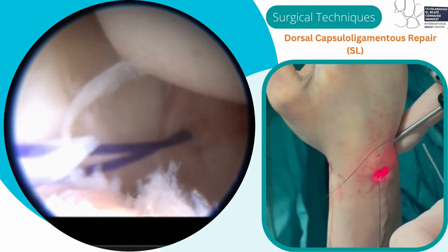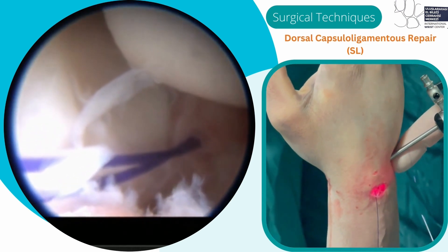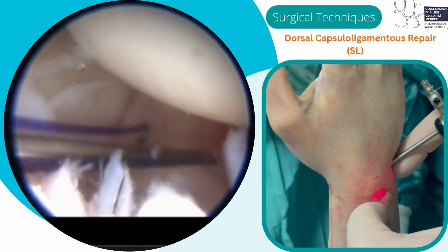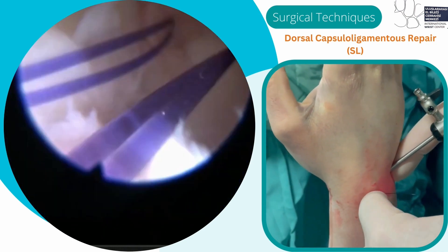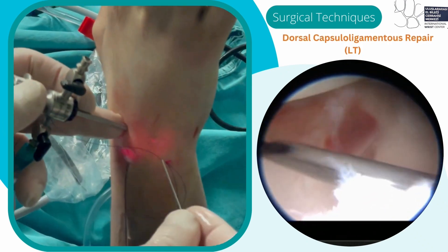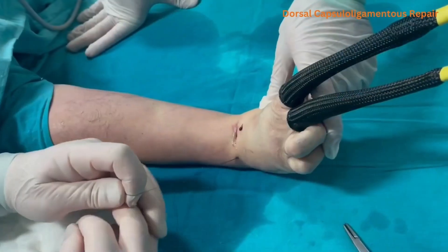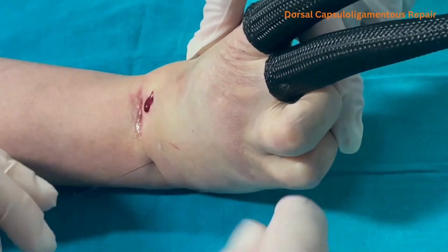The sutures are passed through the dorsal capsule and the remnants of the intrinsic ligament via the 3-4 radiocarpal portal. Both distal sutures are retrieved by 2 different portals in the distal transcapsular area at the MCR portal. Similar techniques are used to repair the LT ligament. The traction is then released and the wrist is extended to tie the last 2 proximal sutures via the 3-4 and 6R portal.